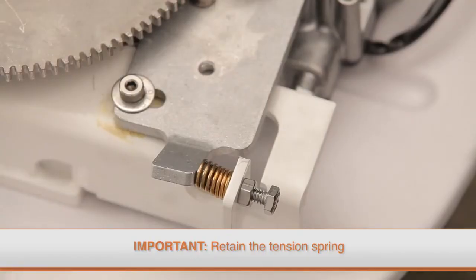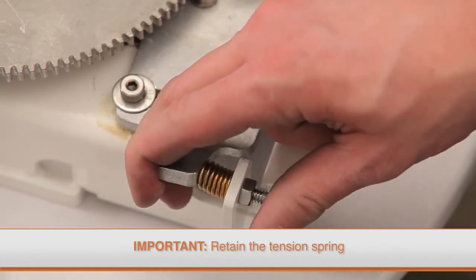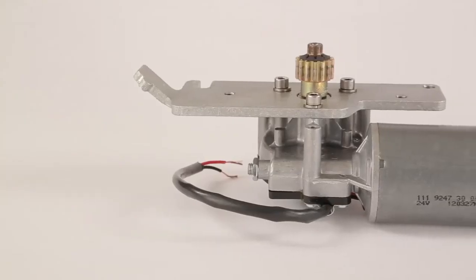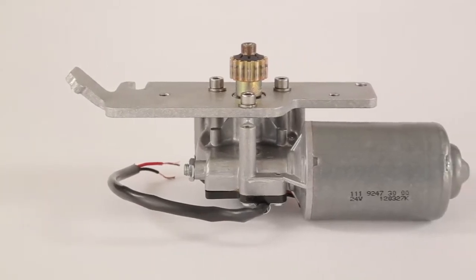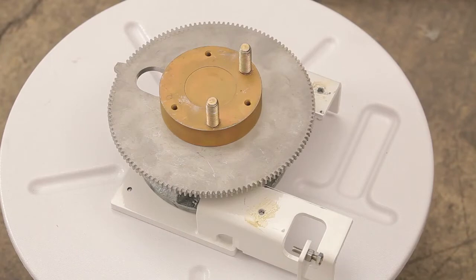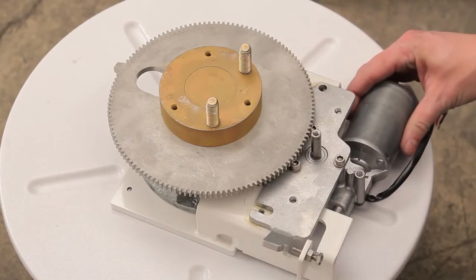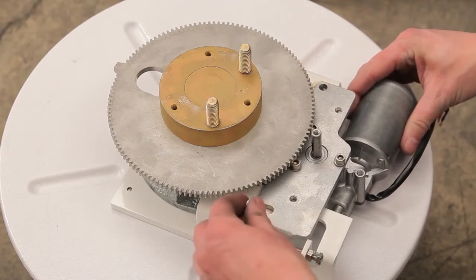When removing the motor assembly, make sure to retain the tension spring that fits between the motor assembly plate and the base frame. This spring will need to be reinstalled with the new motor assembly. When replacing the assembly, simply align the holes in the motor assembly mounting plate with the holes in the base and insert the screws and tighten.